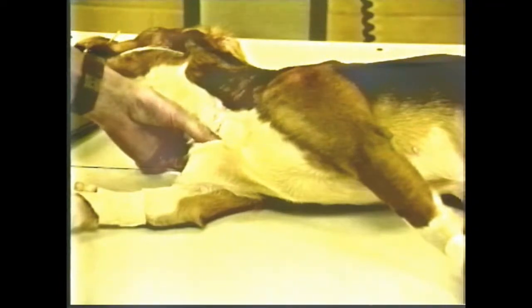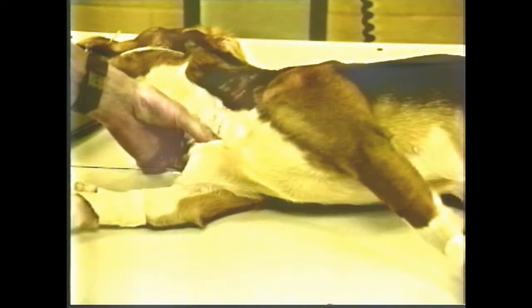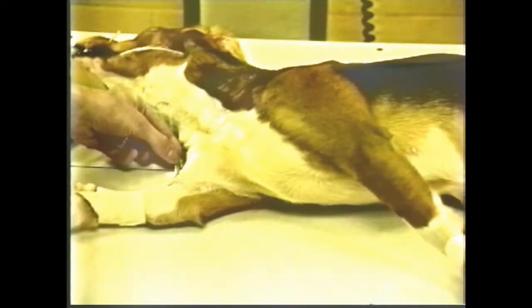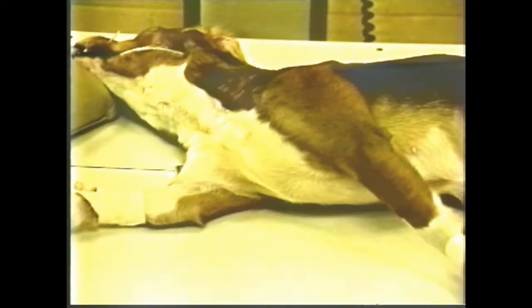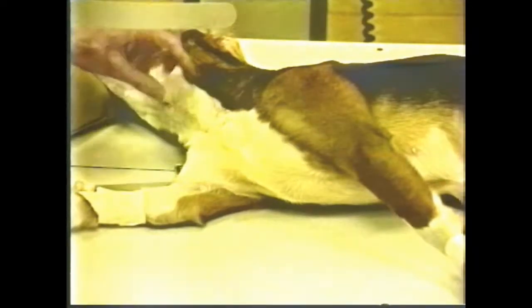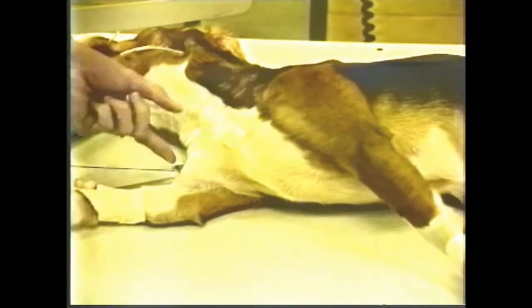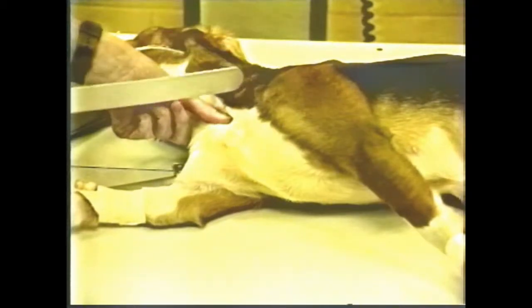The acromion and greater tubercle is palpated so that the shoulder can be identified. The shoulder needs to be cranial to the thoracic inlet. A marker is placed on the film so that the proper leg will be known. The measurement is made and the technique is set.